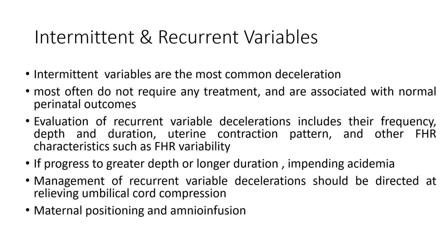If you have recurrent variable deceleration, you have to see the frequency, the depth, the duration, and other fetal heart rate characteristics such as the variability. If the variables are becoming more and more deeper or taking more time, then this means that there is an impending acidemia, that the variables are progressing, and acidemia will occur in the future.